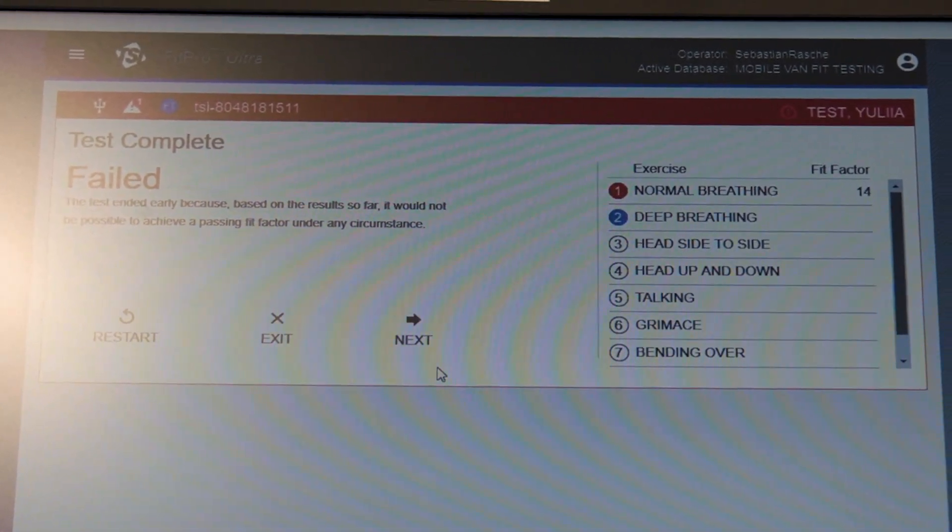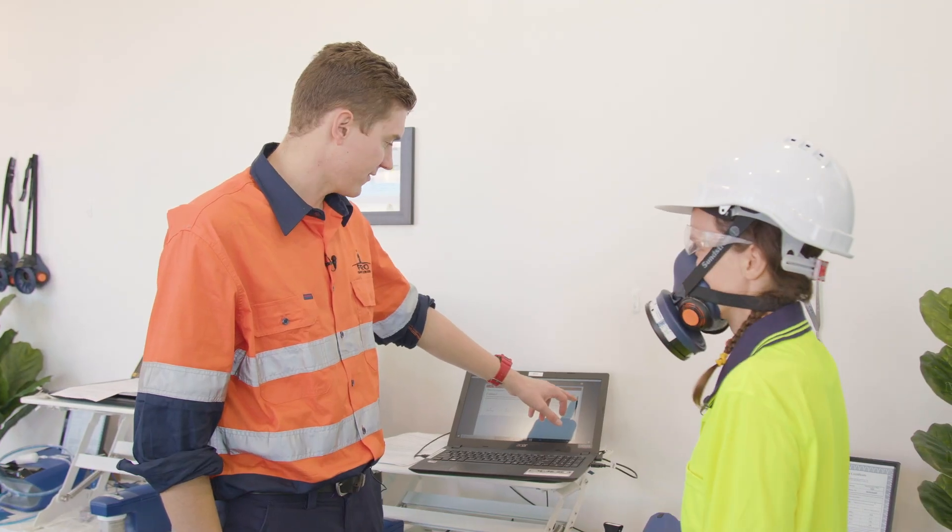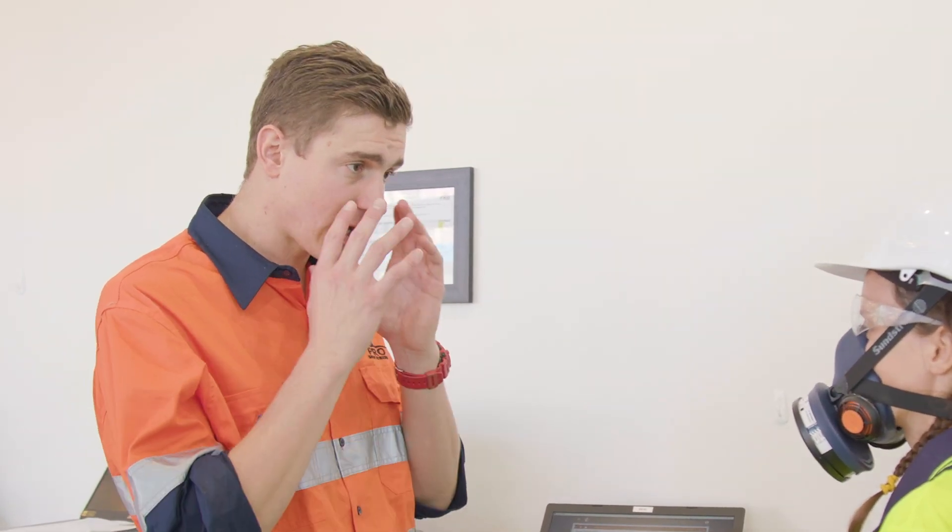So Yulia, you basically failed the first exercise — you've only scored a fit factor of 14, and to pass you need at least 100. So a medium large on your face is way too big.